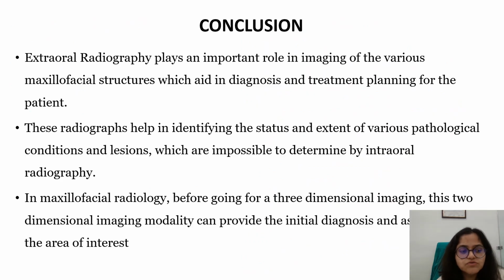So, coming to the conclusion, extraoral radiography plays an important role in imaging of the various maxillofacial structures, which aids in the diagnosis and treatment planning for the patient. These radiographs help in identifying the status and extent of various pathological conditions and lesions, which are impossible to determine by intraoral radiography. In maxillofacial radiology, before going for any 3D imaging, this two-dimensional imaging modality can provide the initial diagnosis and the assessment of the area of interest.